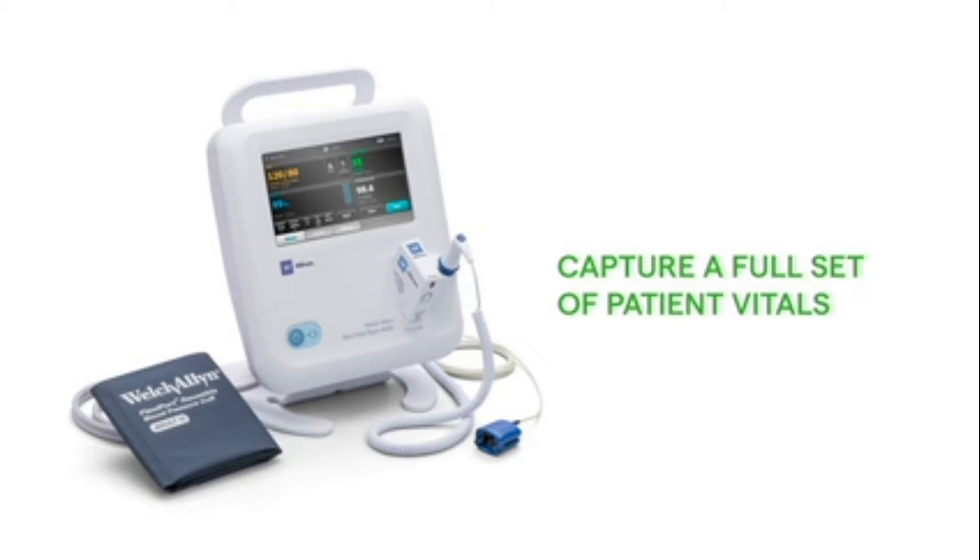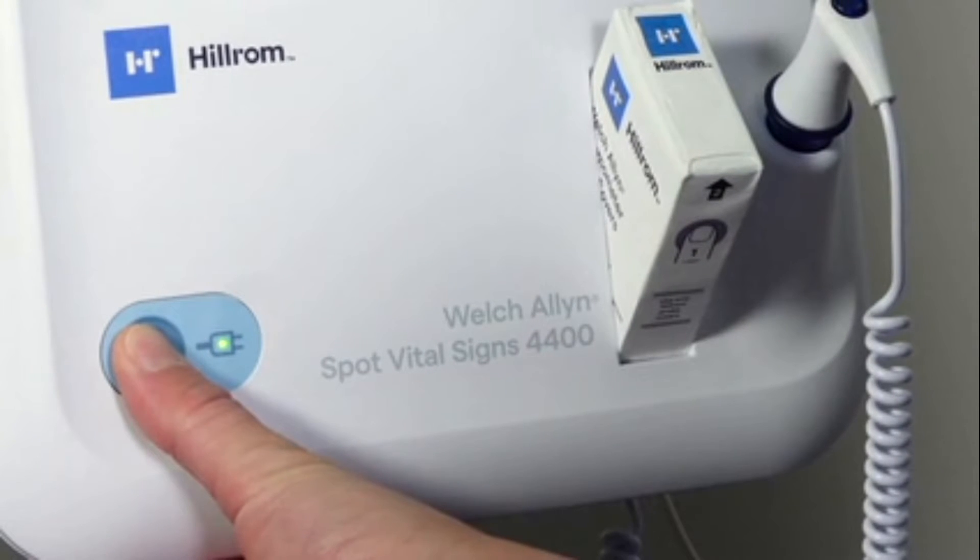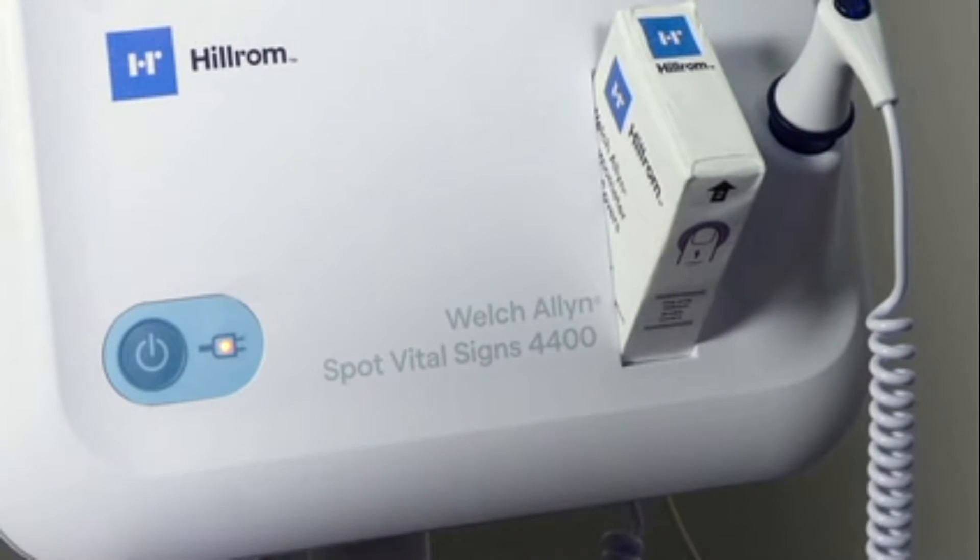Begin by turning on the device. Simply press and hold the power button for two to three seconds. Once the device has powered up, the home screen will appear.